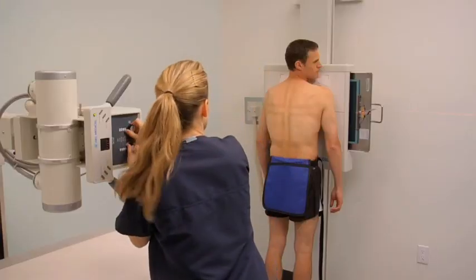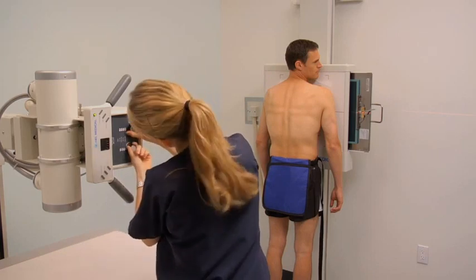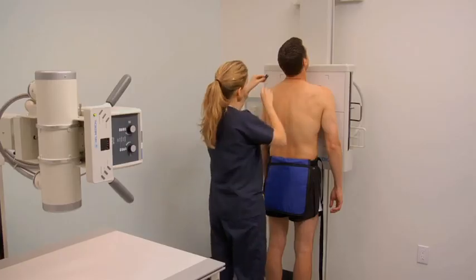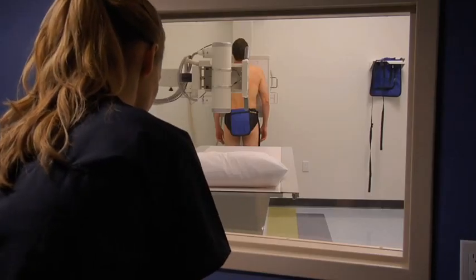Collimate the light field to 1.5 inches above the shoulders and include the lateral soft tissue borders of the chest and the diaphragm. Instruct the patient to raise their chin. Position the inverted left lead marker on the upper left corner of the image receptor within the light field. Stand behind the protective lead barrier.